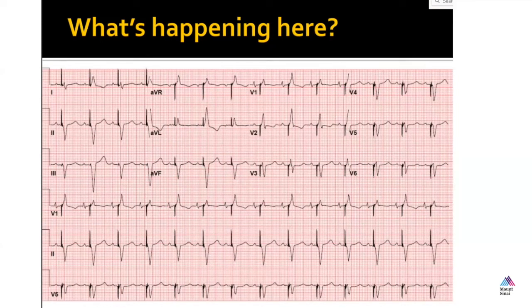Now, the other option is that we could turn on a so-called MVP or minimized ventricular pacing modality, where the pacemaker is essentially an AAI pacemaker, allowing for a very long PR interval. And then when it detects the absence of a QRS following a P wave, it will then revert to DDD temporarily.